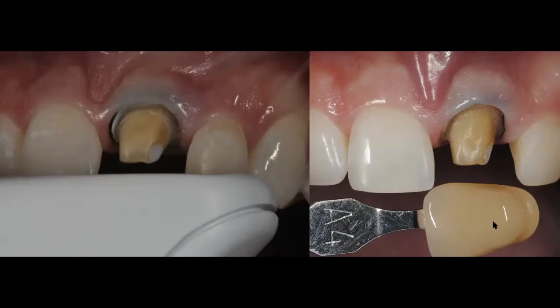Because don't forget that the lab is only going to have a cast, and that cast is either going to be yellow or white stone or green stone, whatever color stone they're going to be using. That's what they're going to have. So they're not going to be able to see this, and that's why it is so important.